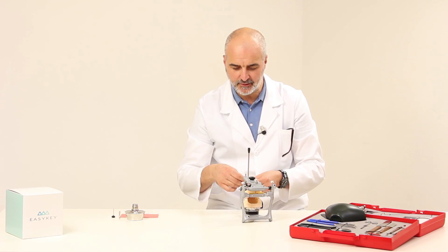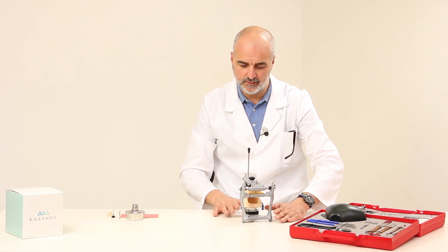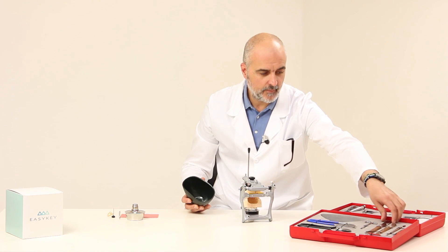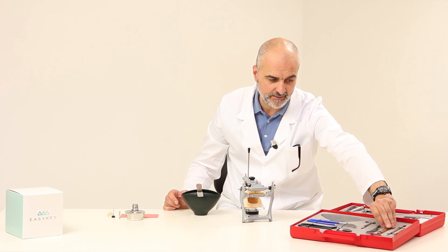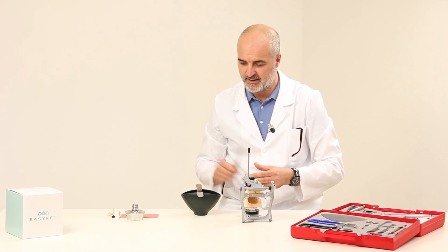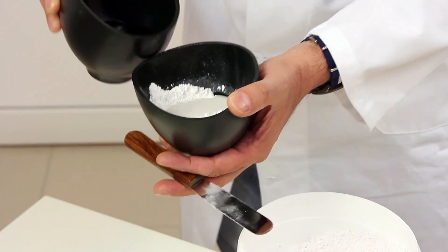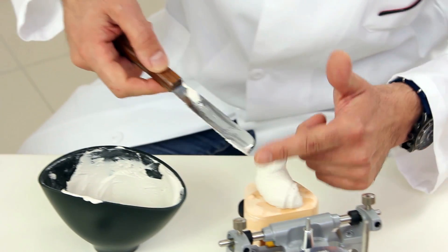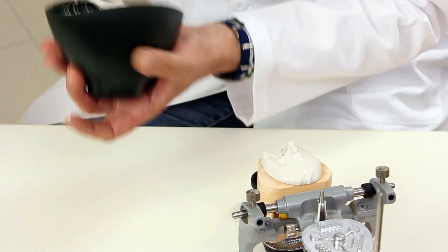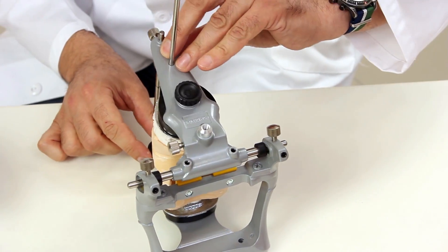To do this, we remove the rubber band we placed earlier and start plastering the models using the tools contained in this small case: the bowl, the spatula to mix the plaster, and the plaster knife for finishing the plaster itself. The plaster should have a creamy consistency — it should not be too fluid. We pour the plaster on the articulator base and on the plate, making sure it adheres well. Then we close and remove any surplus plaster using the plaster knife.